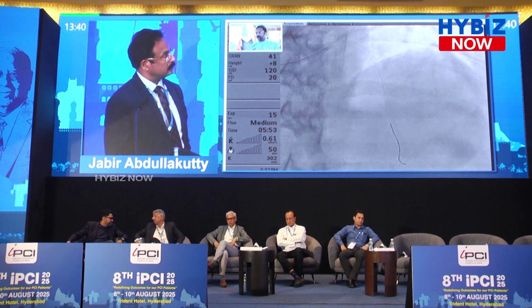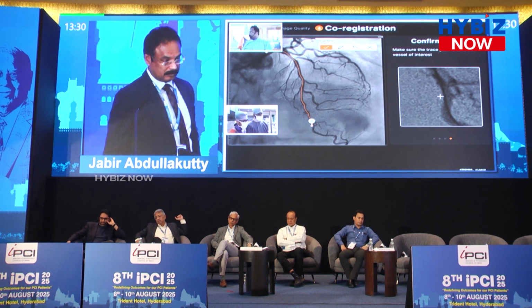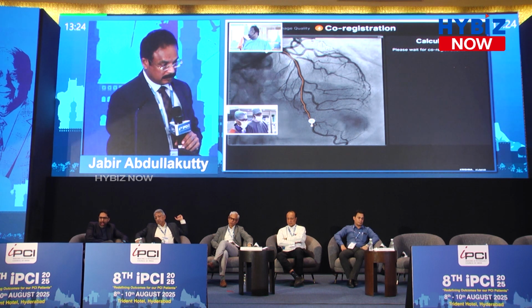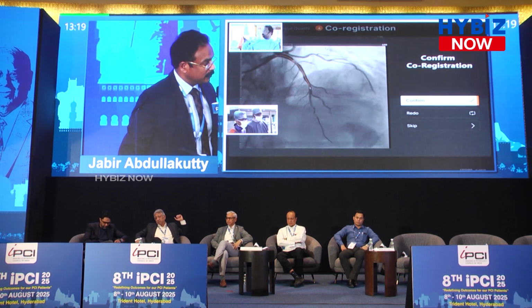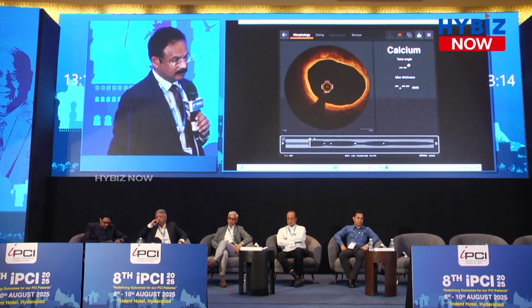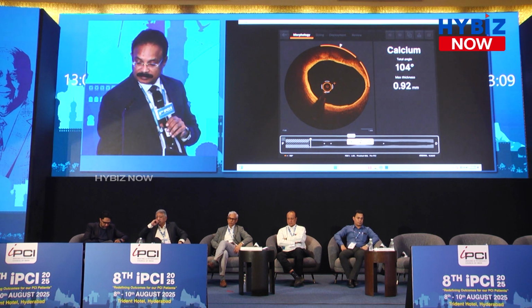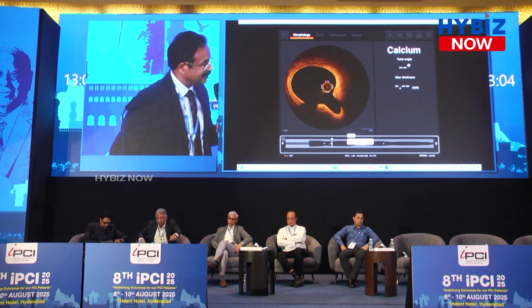So we thought of an imaging guided PCI, the optical coherence tomography in this patient. So now we are going for the co-registration. Can we shift to the OCT images? We'll show the OCT images from the workstation. This is the OCT image. Chairpersons, would you like to interpret?